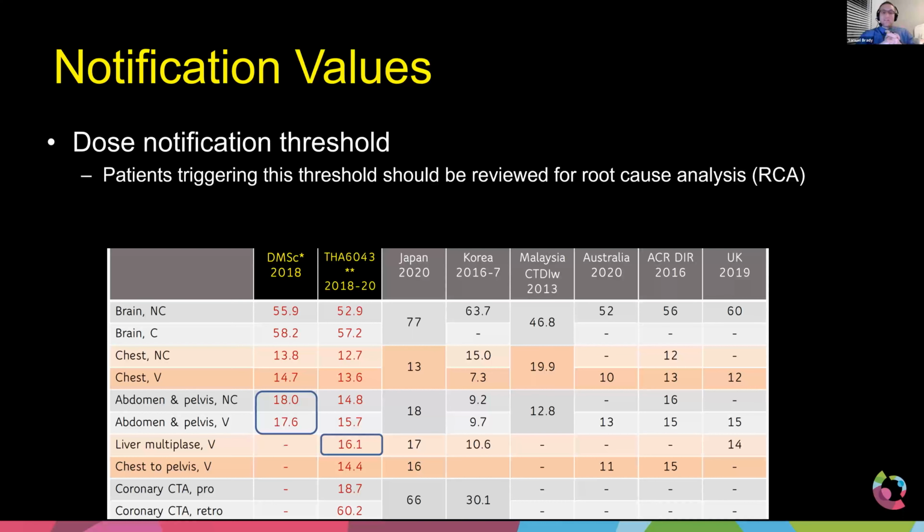And then getting the faster scanners. It's just the faster you go, the better the image quality. It just always will be. And so less repeats.